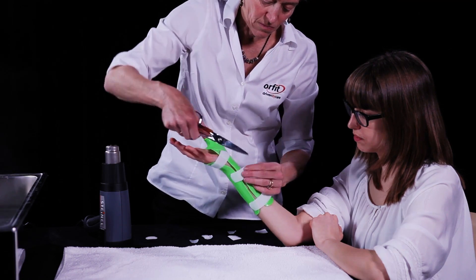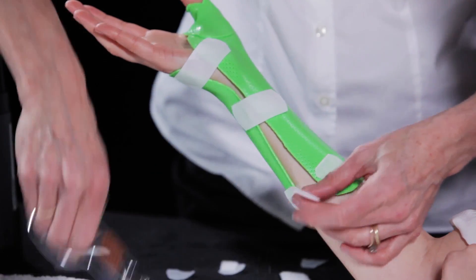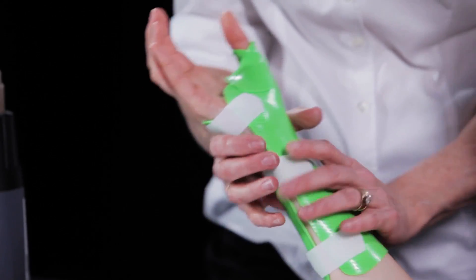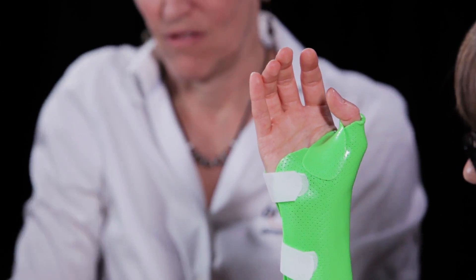The orthosis should secure the wrist in slight extension and the thumb in a functional position while allowing full flexion and extension of the fingers.